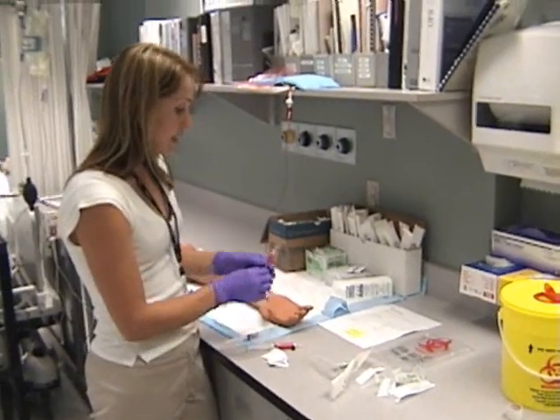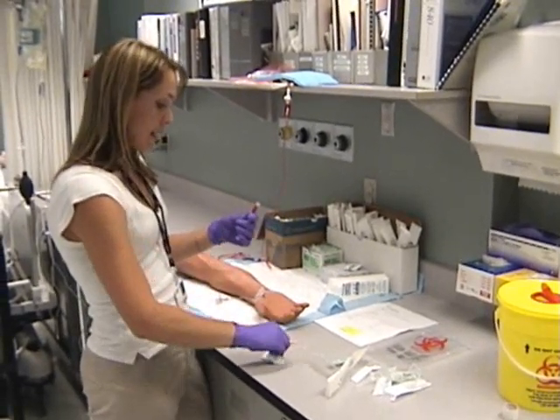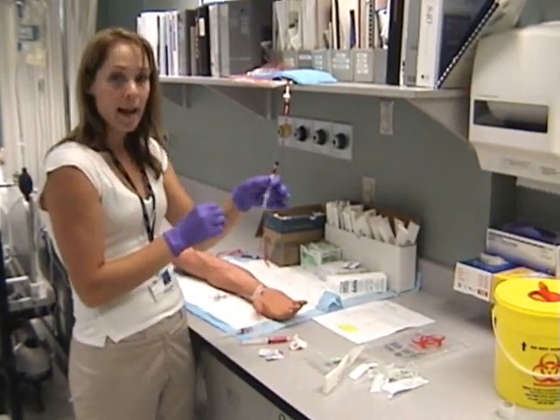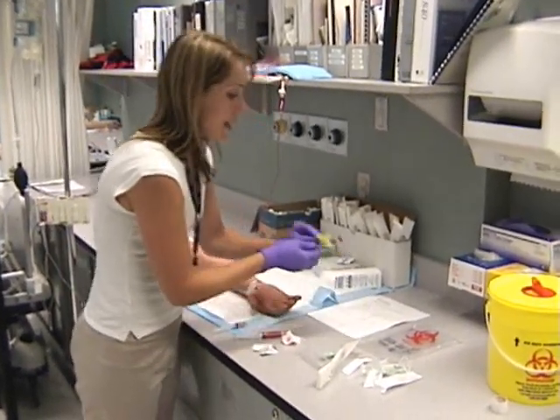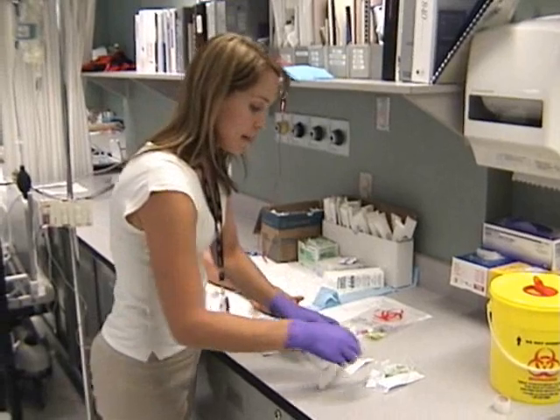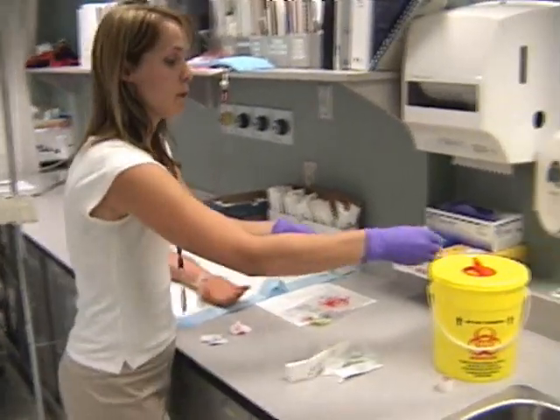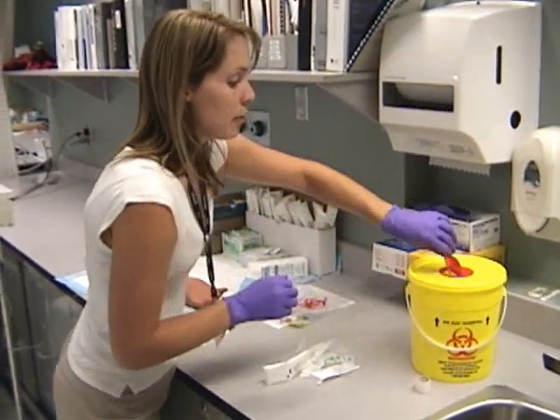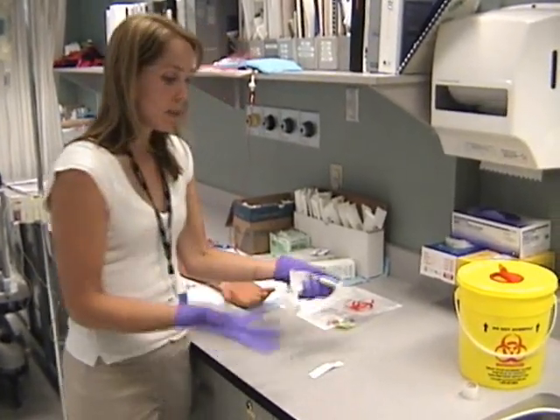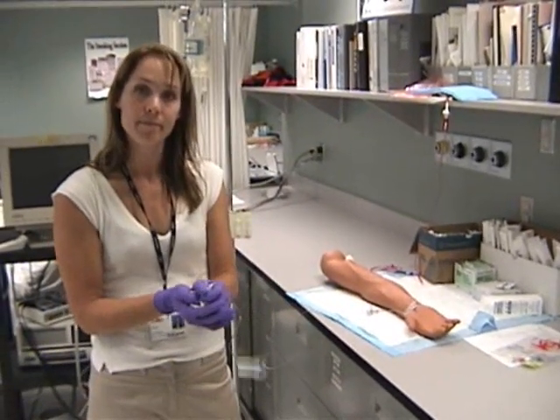Now clean up. Take your arterial blood gas sample, remove the blunt plastic cannula, make sure there are no air bubbles in your sample, and put the cap on it. Label the sample and put it in the biohazard bag with your requisition. For the rest, make sure you separate your sharps — the blunt plastic cannulas are considered sharps and will go into the sharps biohazard container along with the needle from the arterial blood gas kit. The rest can go into garbage. Doff your gloves and wash your hands again.